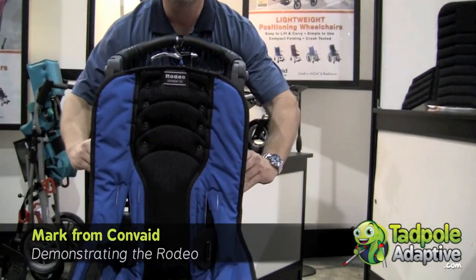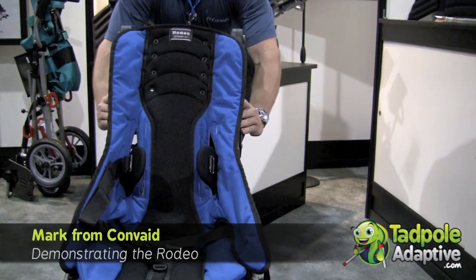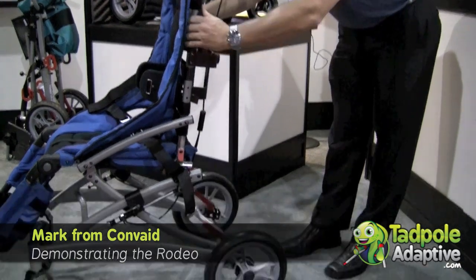We're at MedTrade 2010. One thing we've now incorporated in our Rodeo is 20 degrees of recline. It never had recline in the past, but now it does — very easy to do just by depressing these black levers right here.